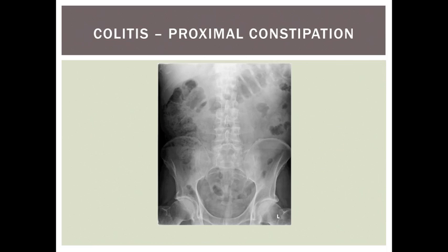In this x-ray you can see a dappled or pixelated appearance in the ascending colon on the patient's right. It's unusual to see solid stool in this area, as the colon works to turn liquid stool from the small bowel into formed stool by the time it reaches the rectum. This patient has left-sided colitis, which can result in disturbance to gut motility leading to proximal constipation. In patients with left-sided colitis, the inflammation in the left colon will not improve until this proximal constipation has been cleared with laxative therapy.